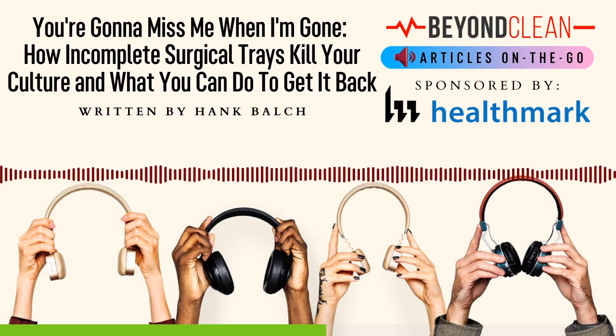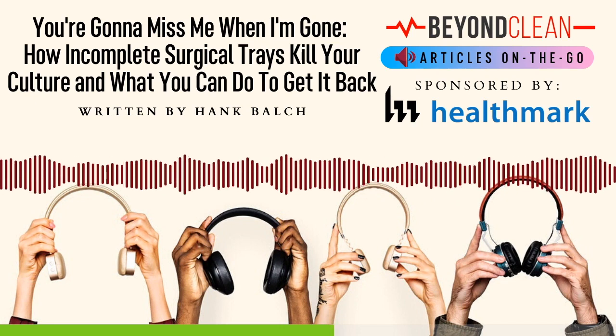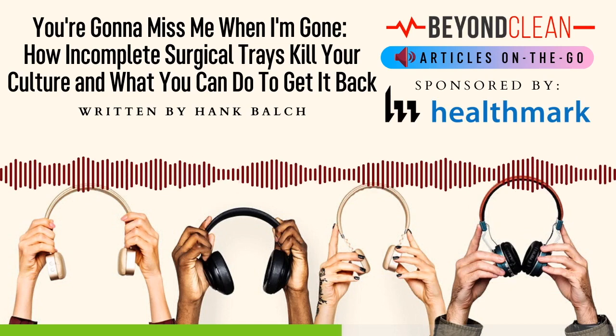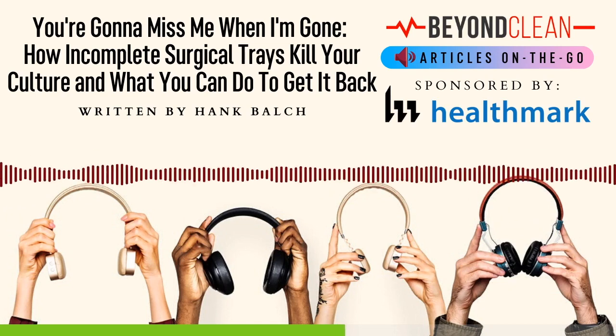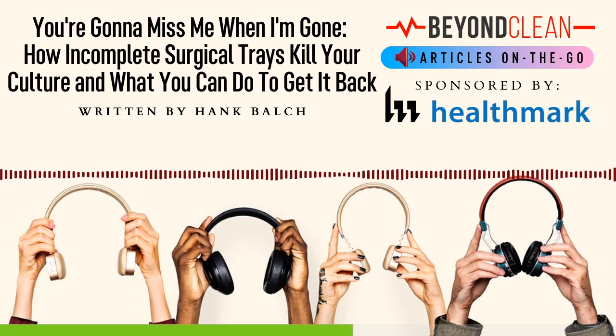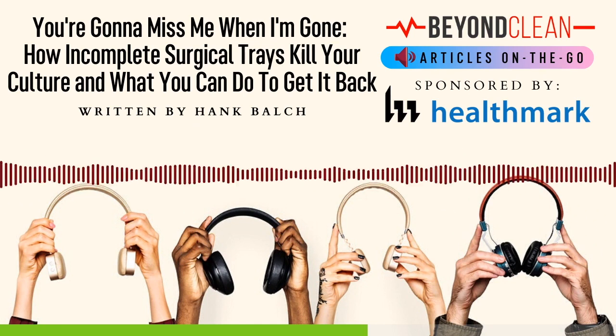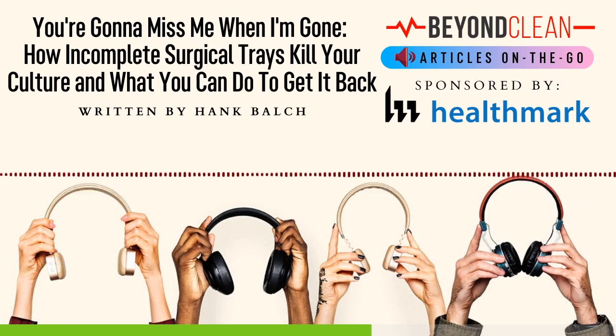3. If they can find it, they will come. Few things are more frustrating for frontline techs than to be processing along at full speed, noticing an instrument is missing, and then knowing it will take them forever to find the proper replacement. Whether you utilize a drawer system, pegboard, or bin storage for your backup instrumentation, the key to success here is organization. Personally, I'm a fan of bin storage because it allows you to see the instruments, unlike the drawer system, and removing an instrument is not as difficult as with a crowded pegboard.